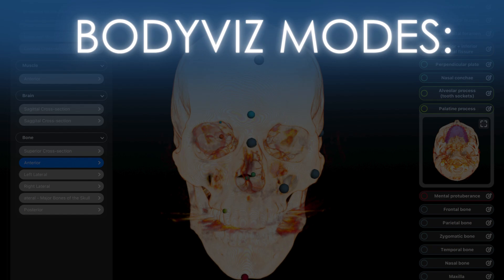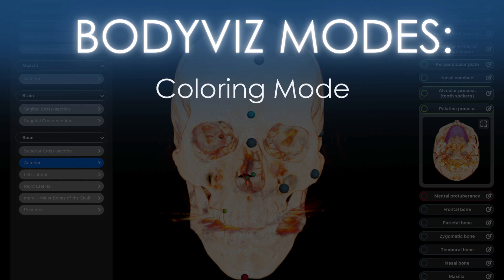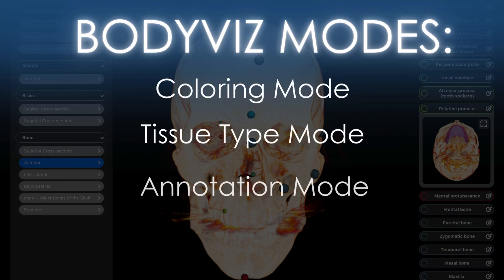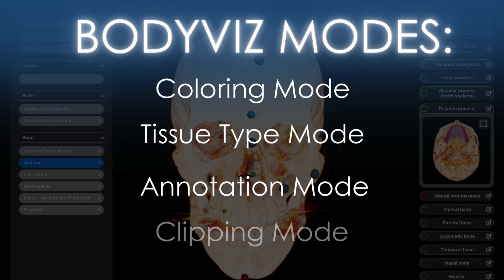The BodyViz app includes a view menu interface and four unique modes: coloring mode, tissue type mode, annotation mode, and clipping mode. By toggling through these different modes, you can explore and customize real patient anatomy in various ways.